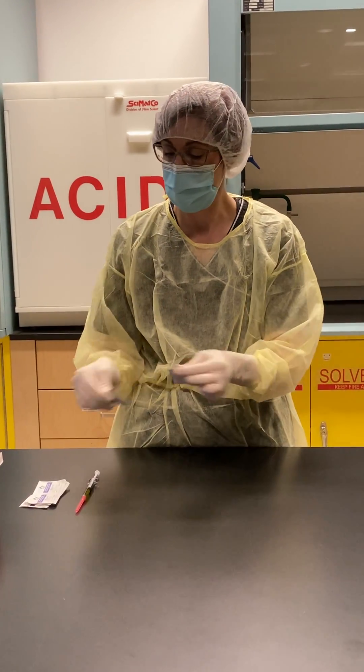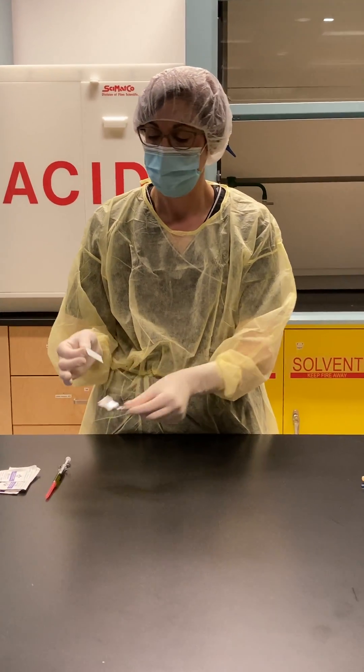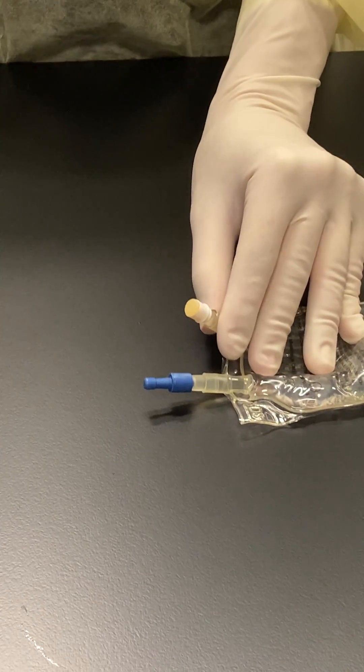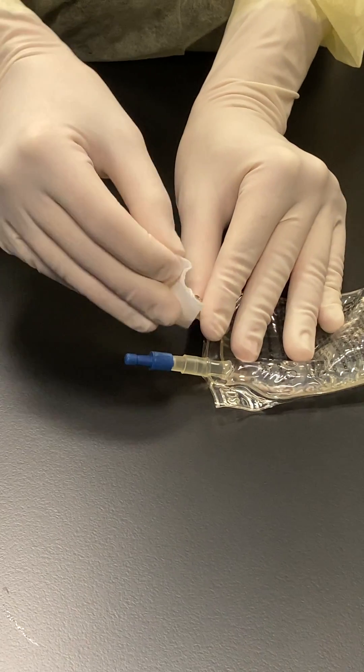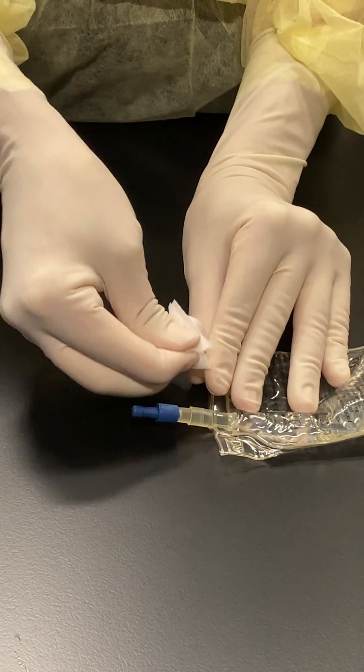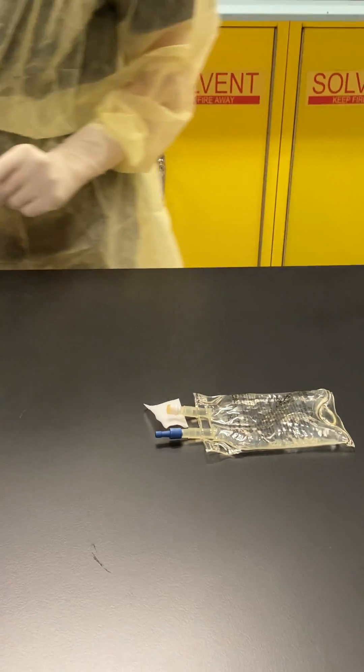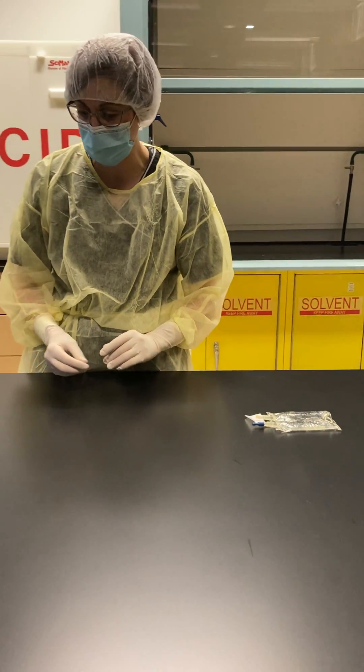I'm going to take an alcohol swab and I'm going to wipe the port of my 50ml dextrose 5% bag and let it dry. Again, that takes about 10 to 15 seconds.